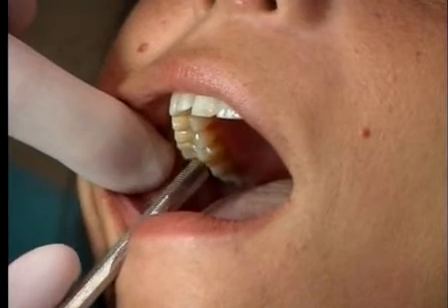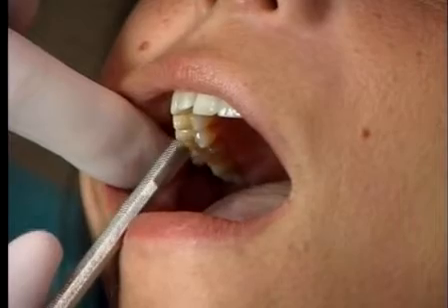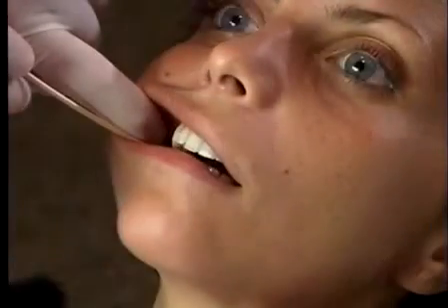Percussion lets us know if there's attachment apparatus disease. We should percuss both the lingual and the buccal cusp. Another great test is the cue stick or the bite test. We should very carefully place the stick on the tooth that we suspect and have the patient gently bite down and then rock left to right to see if they can create any movement in the event of a microfracture.